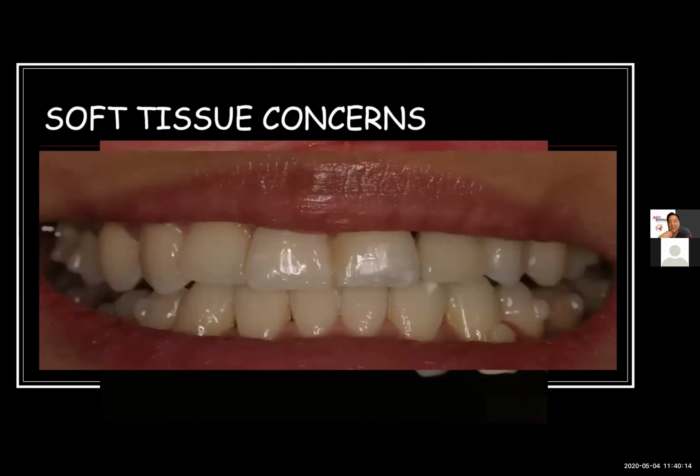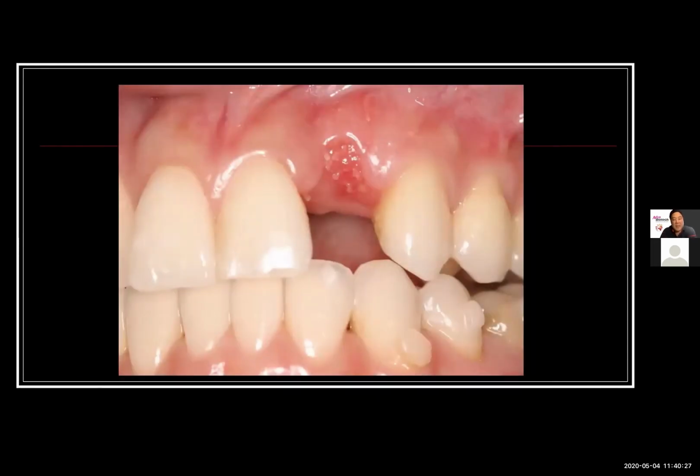And look at this. This is not even a full smile. What do we see? We see that triangle of death. We see that little black triangle. I apologize, this was reformatted. But that dark black triangle, that's all of us treating these highly demanding anterior aesthetic cases when we're dealing with that one implant. And so this is the healing. You can see how even spicules of bone still remained through the soft tissue, but you can see just how it's starting to shape and heal, right?